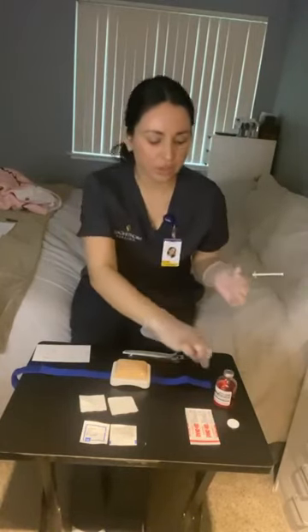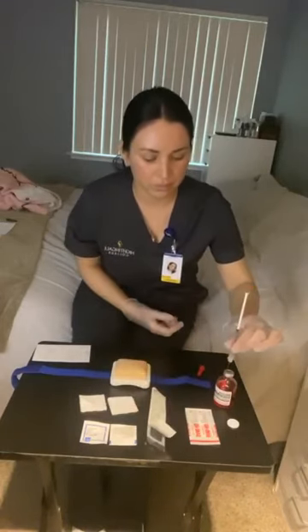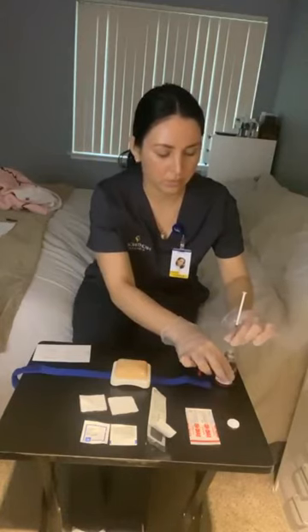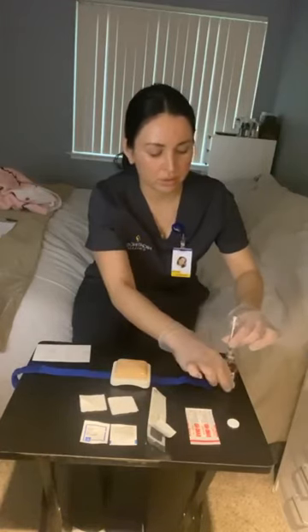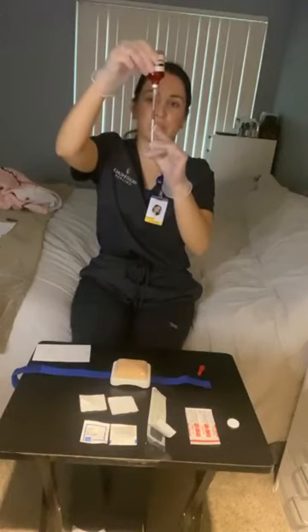I'm going to insert it into the vial, and I'm going to inject the air into the vial. I'm going to hold the vial upside down and allow for the medication to fill the syringe to the prescribed dose of 1 milliliter.